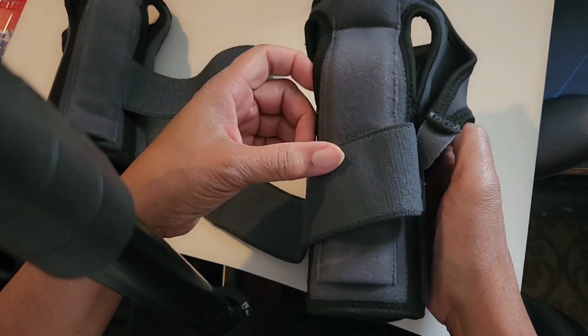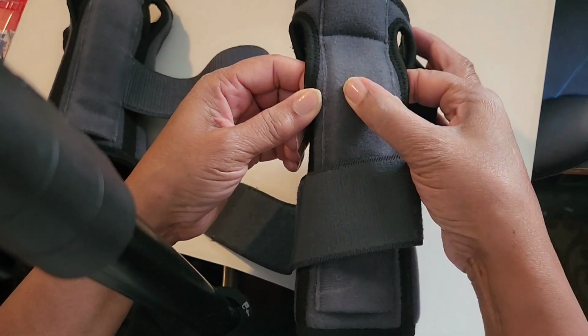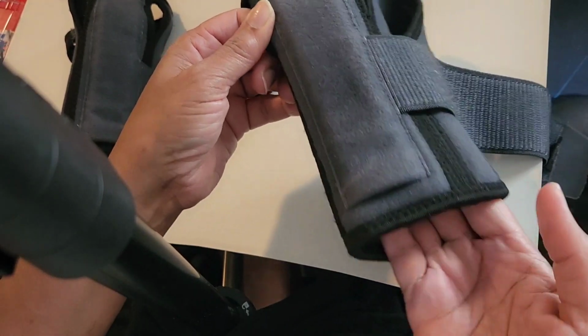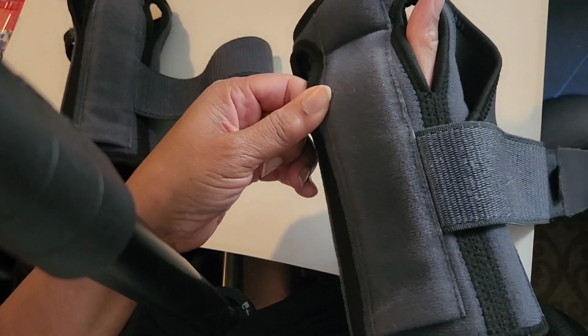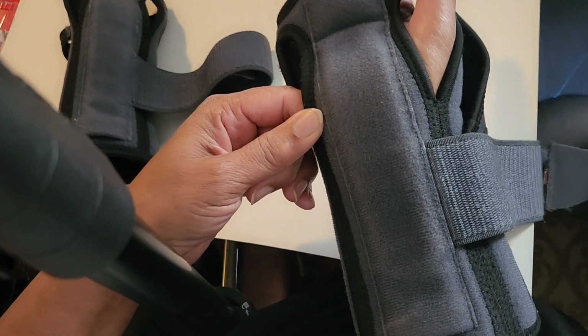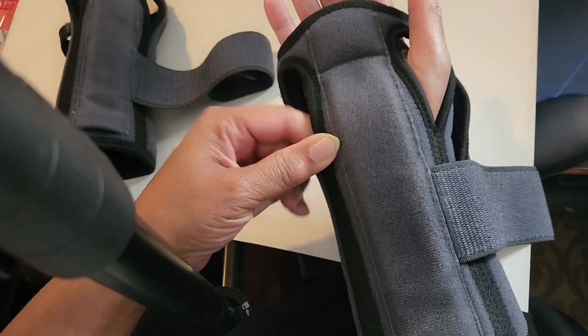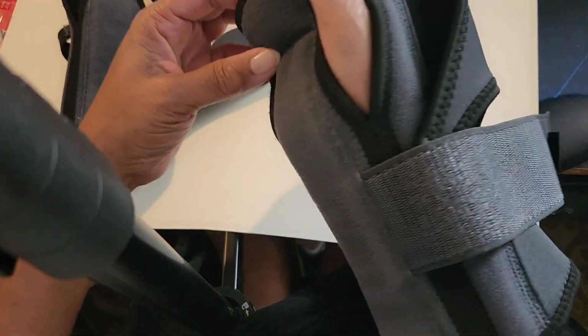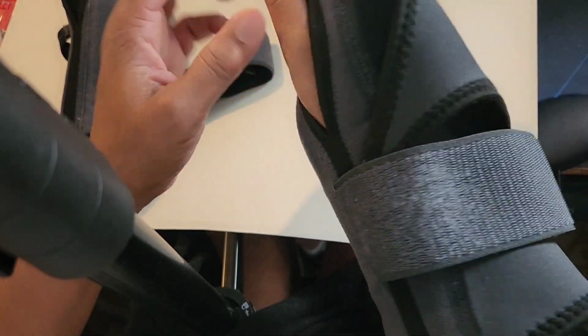Okay, so I'm using this one here. That metal part is right here. And like I said, this is pretty comfortable. I can use the right or left hand. So here, I'm using the right. Then basically, you just have to make sure it's snug, not super tight. You're not trying to get it like a tourniquet.